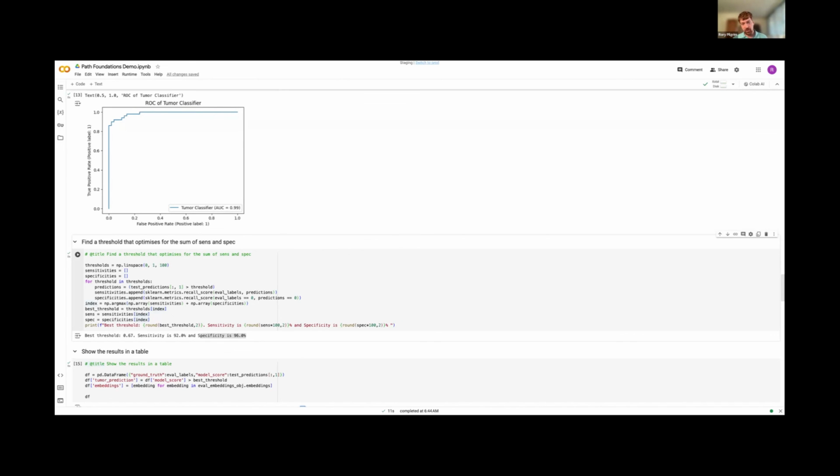And you don't have to run the compute twice. So it's much cheaper for you and much faster because you've already done the hard work at the outset. And that's the important thing to realize: once you've got the embeddings, you can power a huge amount of applications from that very, very efficiently, very cheaply from a compute perspective and from a time perspective.